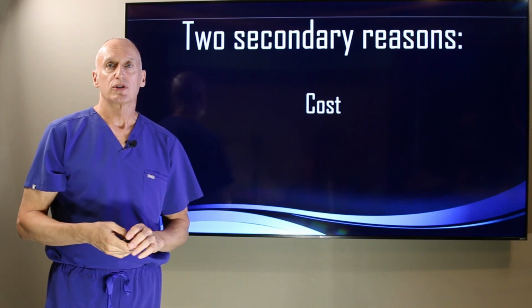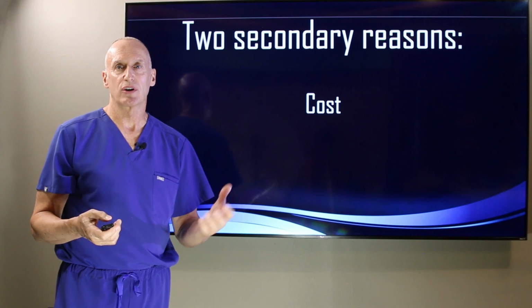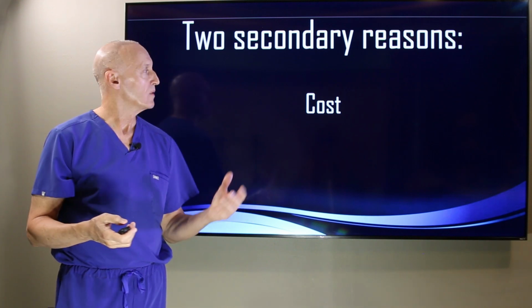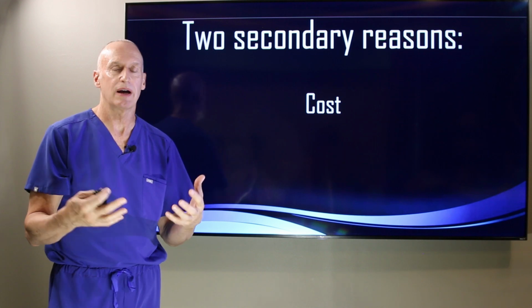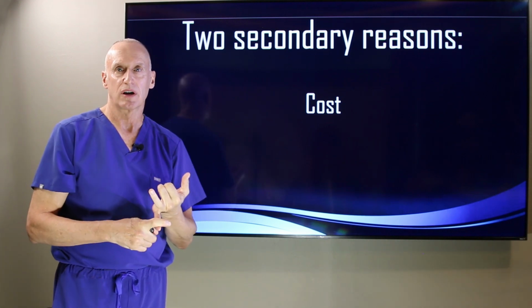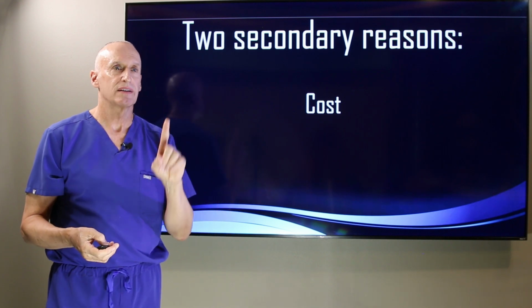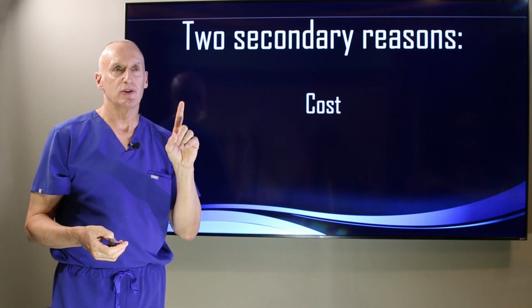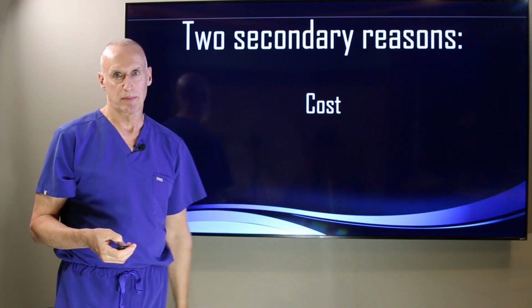The all-on-4 surgeons can do sometimes 4, maybe even 5 arches a day. We're lucky to do 2 because it's just so much more time, and the time does cost more. The prosthesis costs us more, so it is a more expensive treatment, but it's not so much more that you'd be forced to choose all-on-4 over implant bridges.